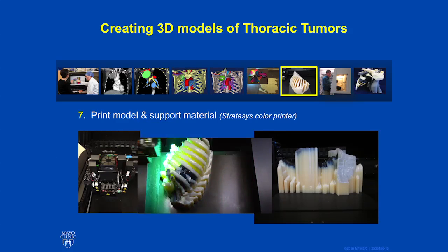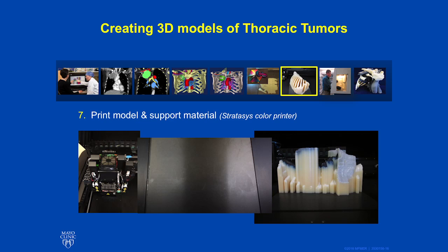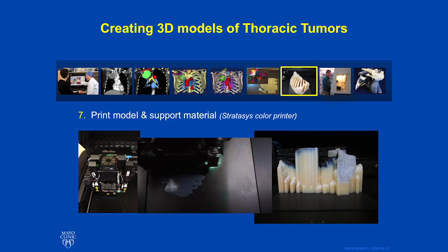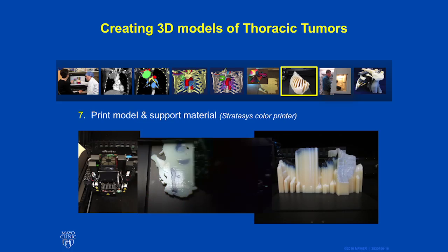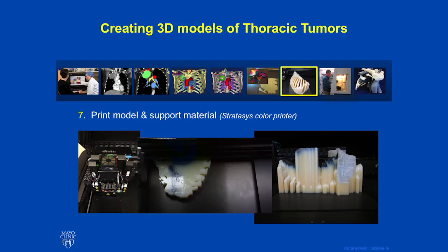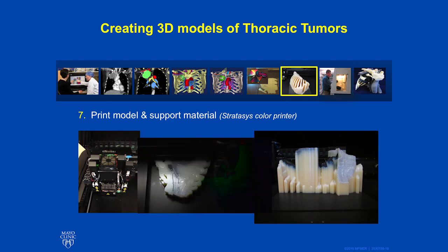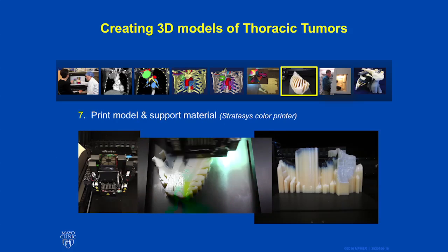This video depicts a time-elapsed printing of a Pancoast tumor. As the spine and the tumor in black can be seen, the printing material initially was not a color model, and this was our black and white and gray model. The different shades of gray represent structures such as the bronchial tree, the aorta, the subclavian artery, the subclavian vein, and different structures.